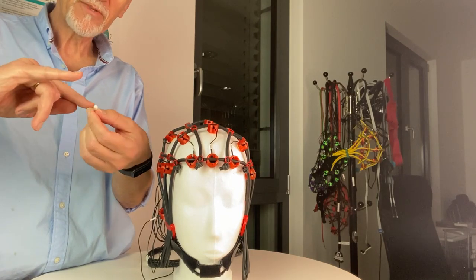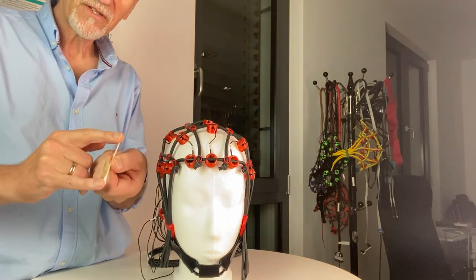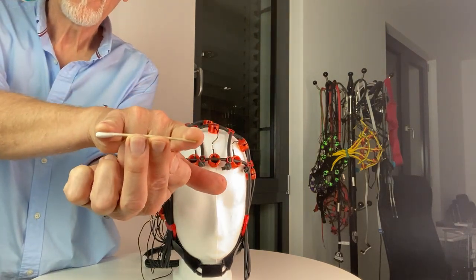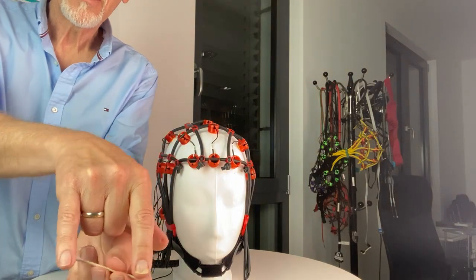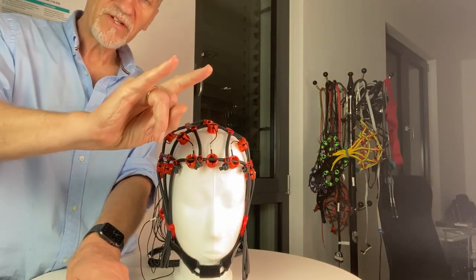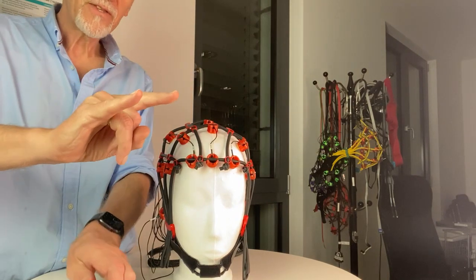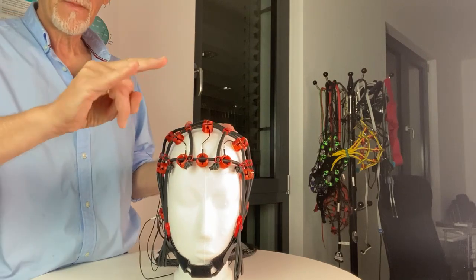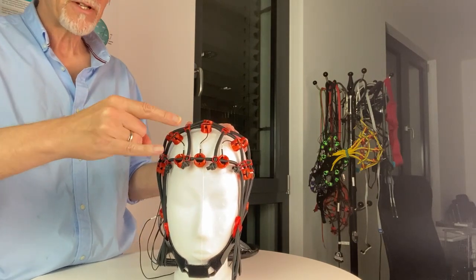I don't want to use templates — I just want to use what I have on my body, and that's the distance between these two fingers. We're using the distance between these two fingers and trying to figure out what works with this measurement trick.